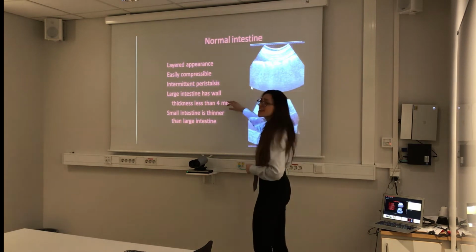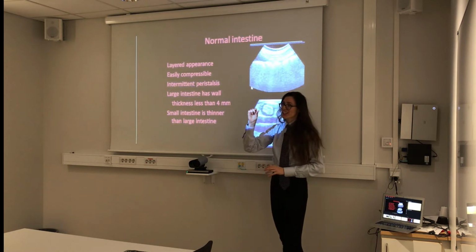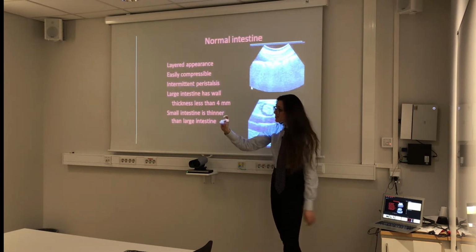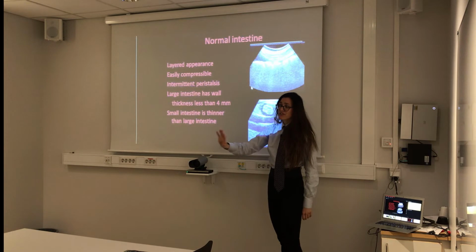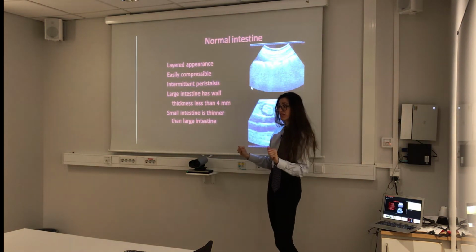If you've got a colitis, it's very straightforward. You cannot miss it because it gets very thick. The air disappears, and you see the edema of the mucosa. And if you set the Doppler, you see the Doppler pumping out, like coloring the whole image.